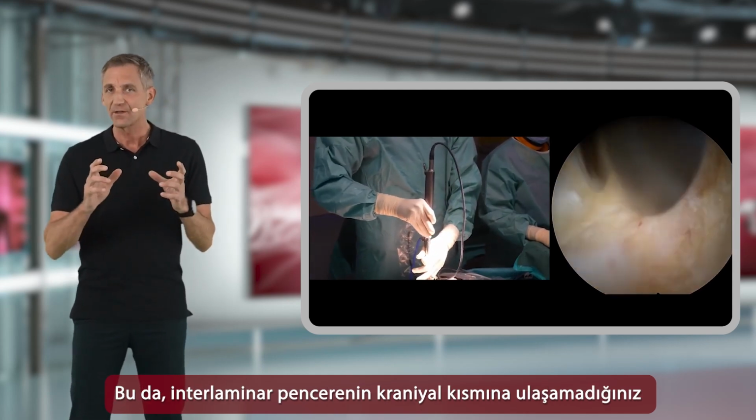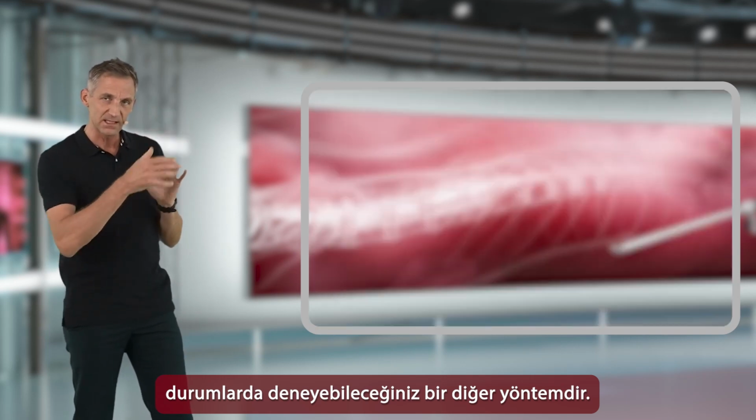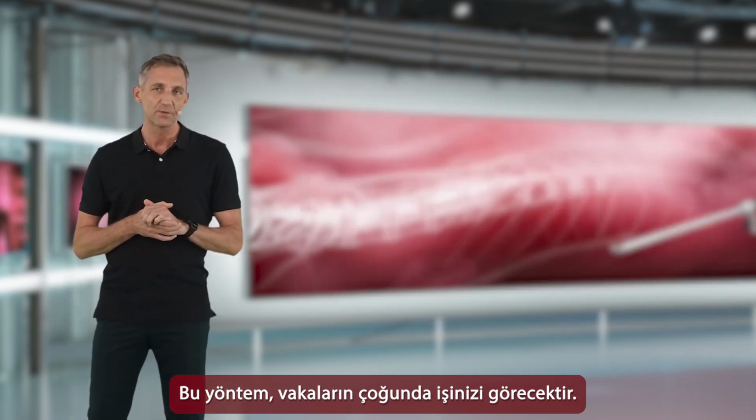So this is one other trick that you can try if you think you can't get to the cranial aspect of the interlaminar window. This will basically do the job in the majority of cases.